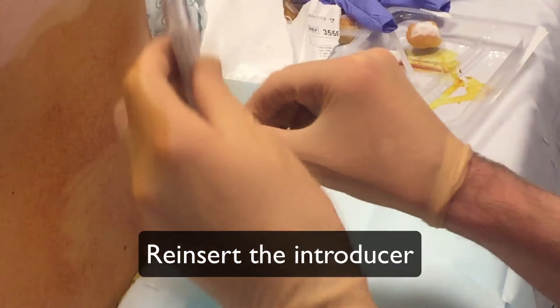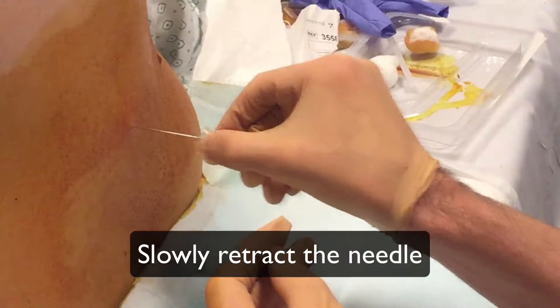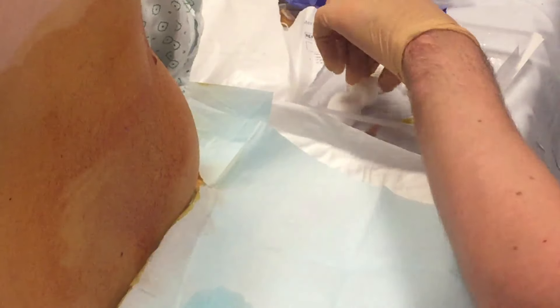Replace the introducer before removing the needle. Leave the patient on a stretcher for several hours to prevent headache and leakage.